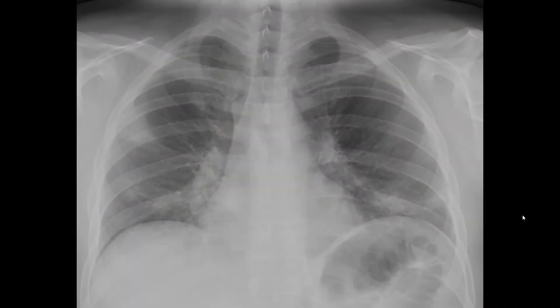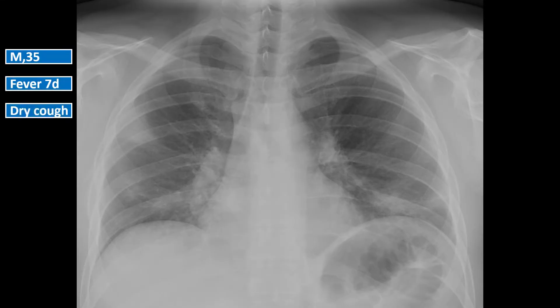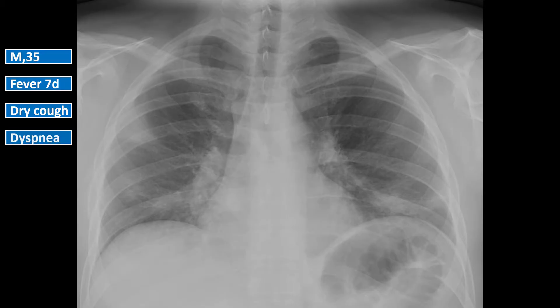Take a look at this. This is a chest x-ray of a 35-year-old man who has had a fever and a dry cough for the last seven days. But since yesterday, he's been feeling short of breath when walking up the stairs, and he noticed his dry cough got worse. When we examine him, his O2 saturation is 93%. What would you say this is?